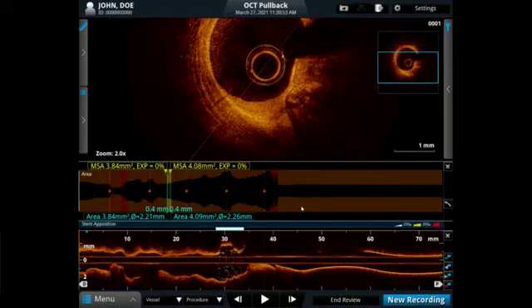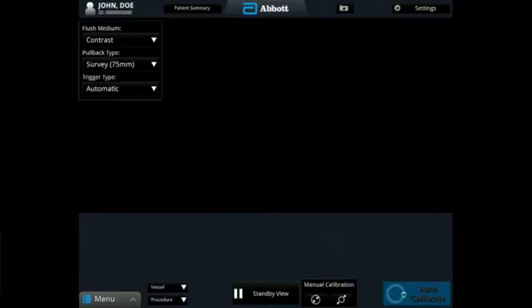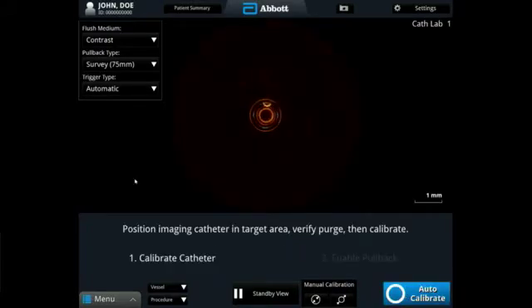So just for the OCT operator, is that Hader who's doing that? Yes, sir. So could you just move the blue marker just for the distal on the previous one, to get what the MSA was, or the MLA was for the previous one? Oh, sorry, that was Nelson handling the OCT. Have you done it? No, we don't. Yeah, I'll do it again.